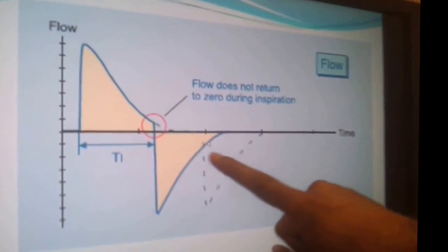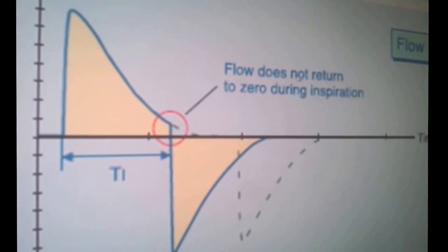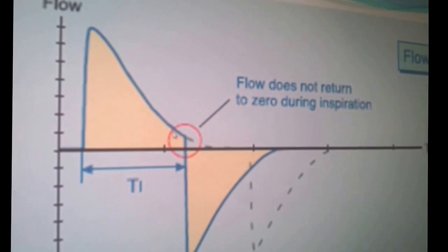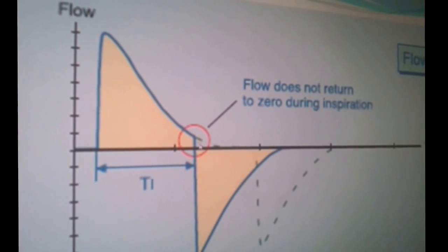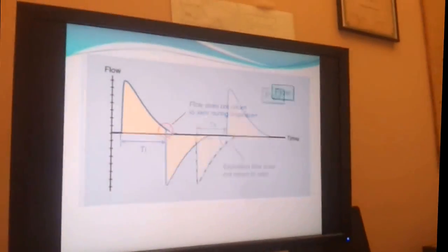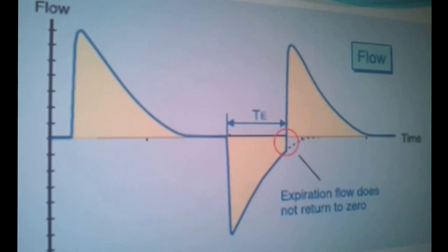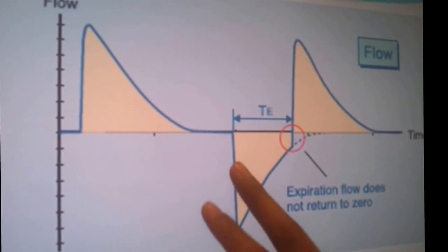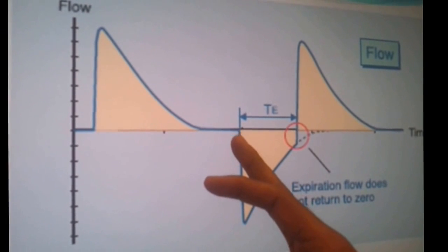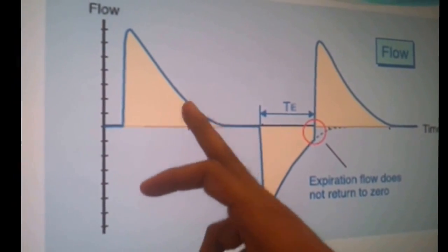So if the inspiratory flow doesn't return to 0, this means that you may not be giving enough time for the air to flow in during inspiration. So you might make the inspiration a bit longer. Okay. This is the graphical representation of what we were seeing before. But if you have such a patient, you can easily see that there is a huge distance between inspiration finishing and expiration starting. So you could easily turn down that inspired time without compromising the inspiration at all.